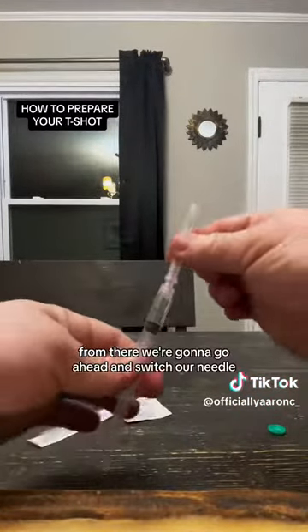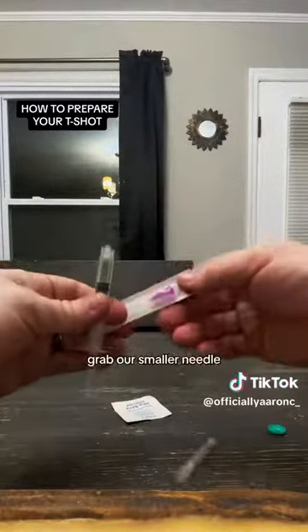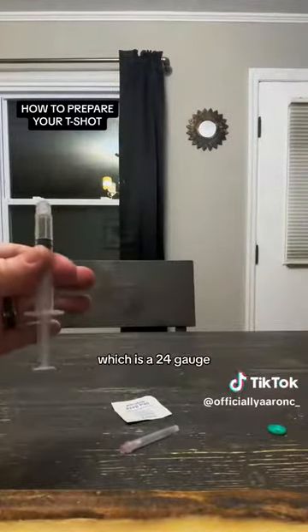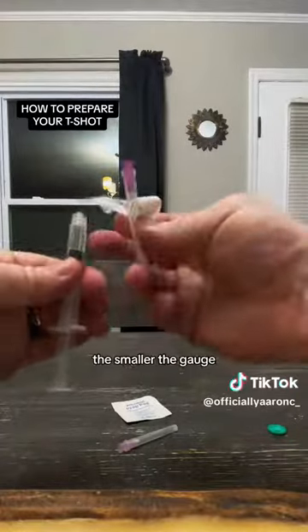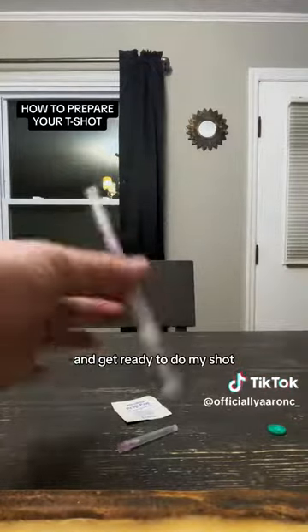From there, we're going to go ahead and switch our needle. Spin this cap off, grab our smaller needle which is a 24 gauge — the bigger the number, the smaller the gauge. Slide that on there, sanitize the area, and get ready to do the shot.